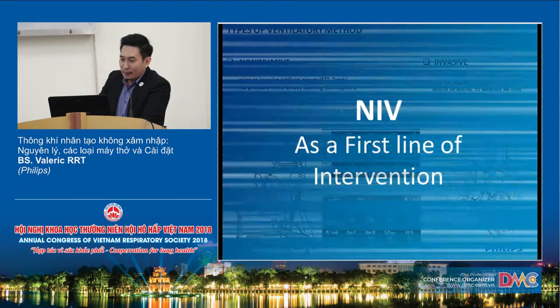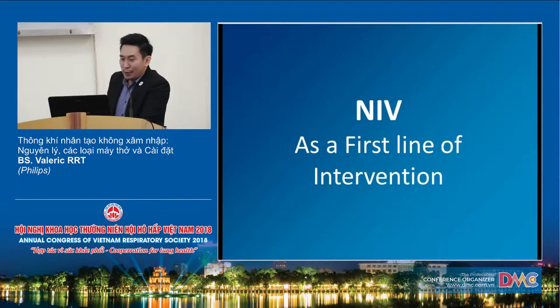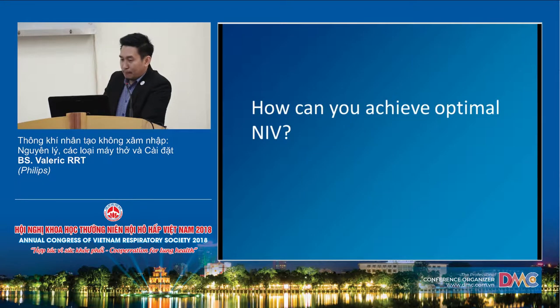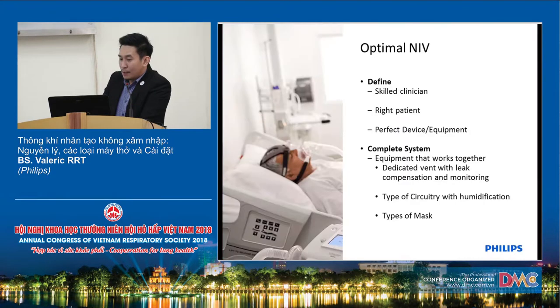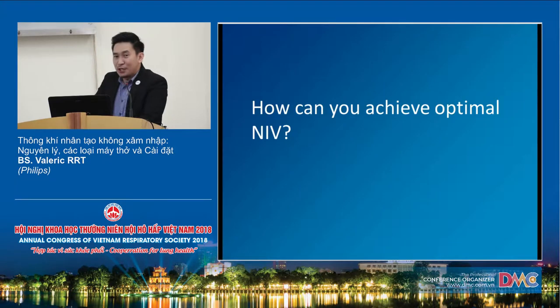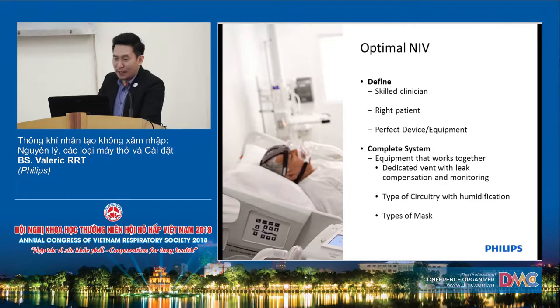Okay, so my next slide. Like what I said earlier, non-invasive ventilation as a first line of intervention. Why? What is the reason behind why we are introducing non-invasive ventilation as a first line? So, okay. How can we achieve the best non-invasive ventilation? In the initiation of non-invasive ventilation, we have to consider different things.